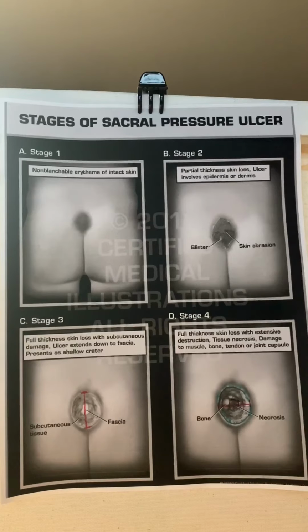This is a strategy that can improve a negative outcome: accurate wound measurement. It will improve wound healing, and it will leave no room for error due to the consistency of the program. This is in hopes that this non-invasive method can improve wound care healing, and some research out there has already seen a linear correlation between the measurement and the time to healing of the actual wound.